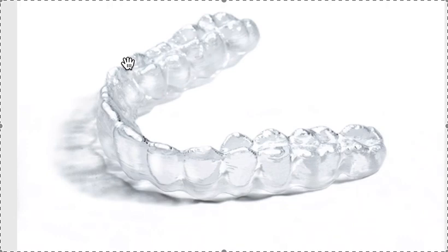So, to be honest, if you have to stay in ClearCorrect and you want to fix your posterior open bite, I would have your patient get heavy masseter Botox to finish up the case. And then you're going to add attachments to the back teeth and close the bite. However, you can prevent it in the future by using anterior bite turbos. So that is the magic.